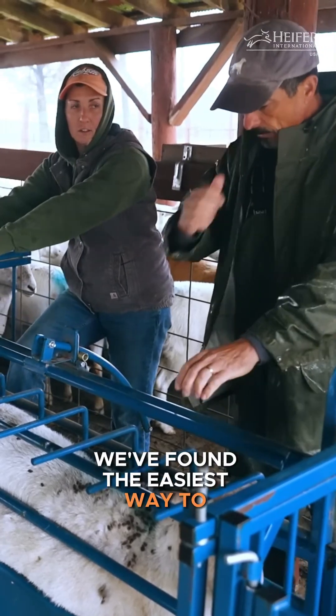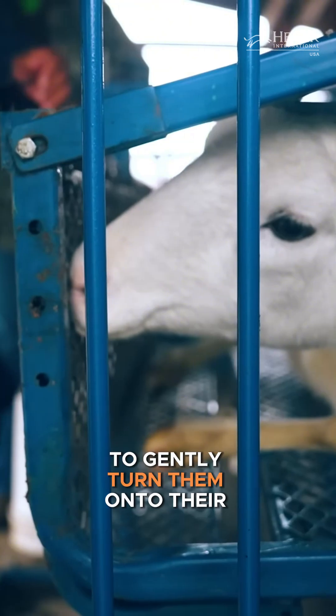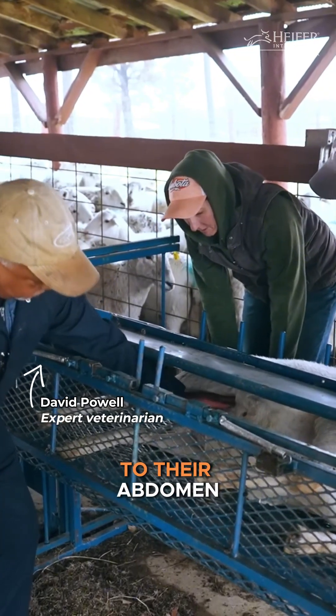We've found the easiest way to ultrasound the ewes is to use the squeeze chute to gently turn them onto their sides, which allows for easy access to their abdomen.